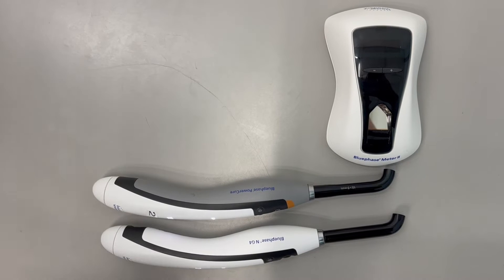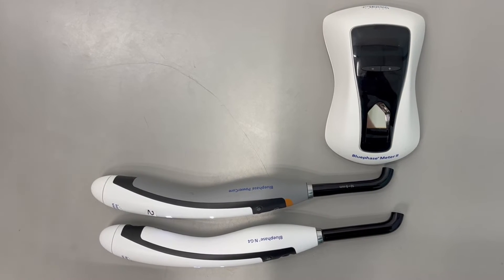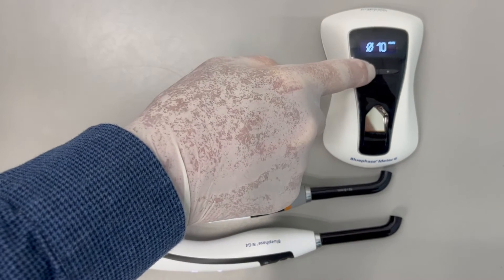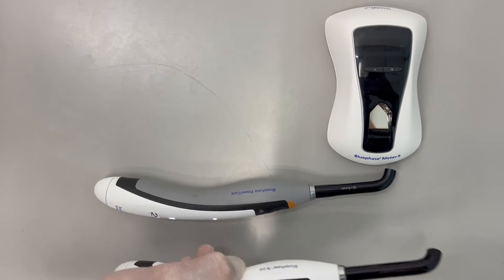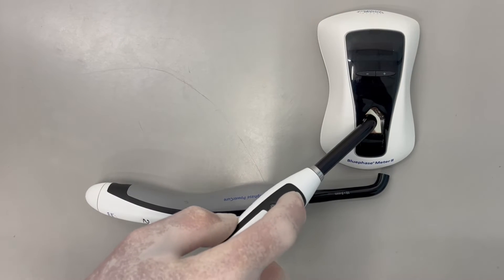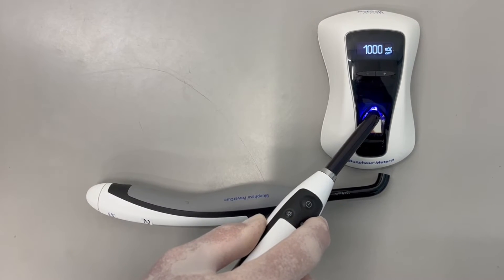When we pick up the other curing light, the NG4, we change the tip diameter to 10mm and place it on the Blufase Meter 2. The irradiance is again 1000 milliwatts per centimeter squared.